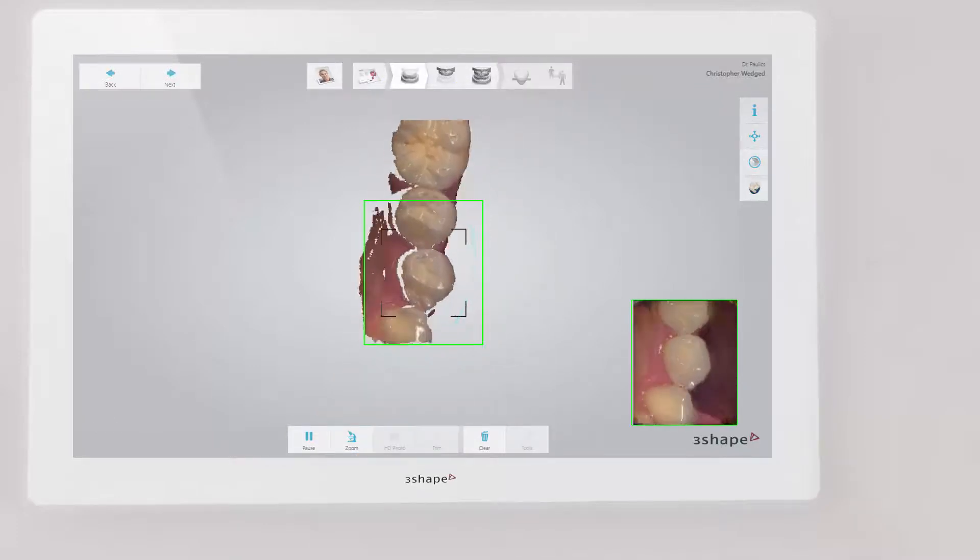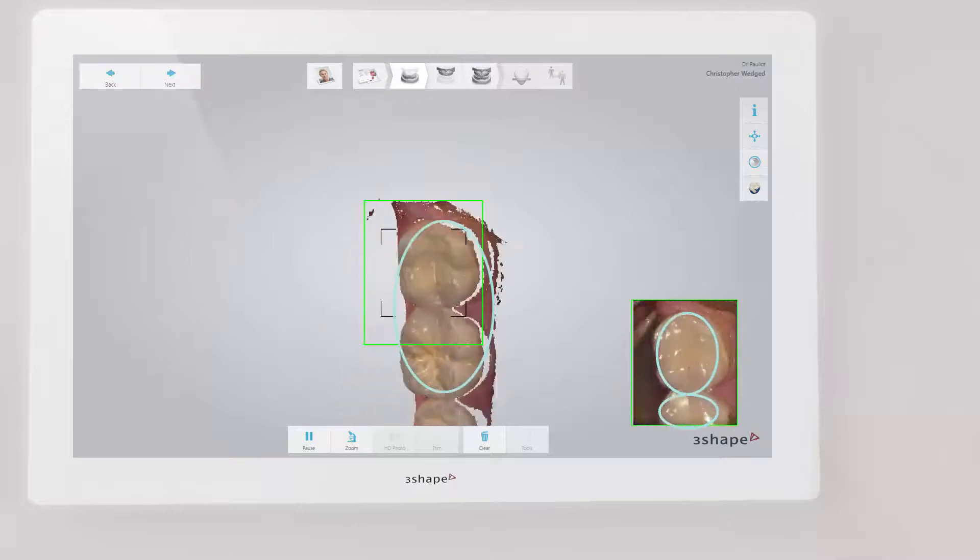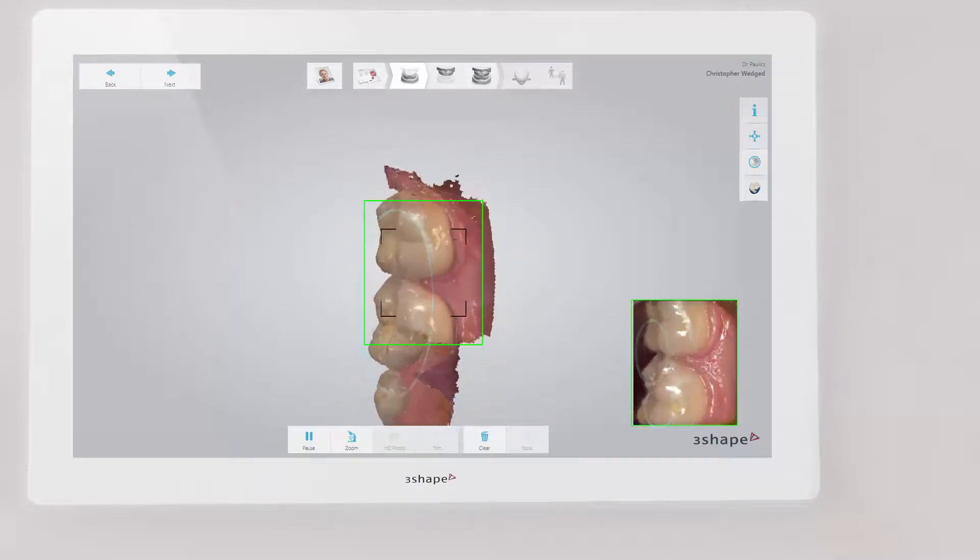If you accidentally scan one or more of these aforementioned artefacts, simply trim away the artefacts and re-scan that area.